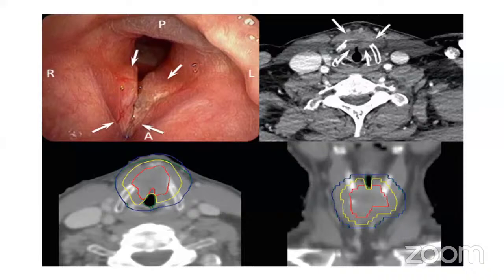And we've seen these images in the previous presentation. I think it's good to look through these guidelines. They're so good, and the images are so representative. I think it's much better than going through a number of different cases, because each one of these is actually a proper case on its own. And that's an advanced T4 larynx, when and if we need to treat it.